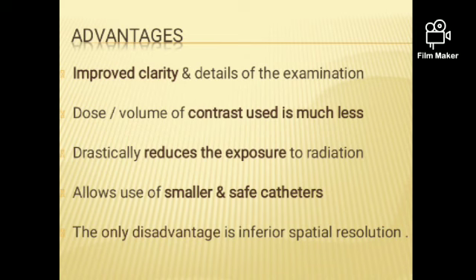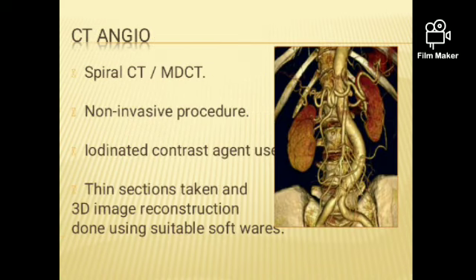It is smaller and safer. Nowadays we have moved from the cath lab directly to CT and MRI, where we can just inject the contrast via a pressure injector, and we don't need to introduce the catheter into the full area. So these techniques are known as the non-selective techniques.